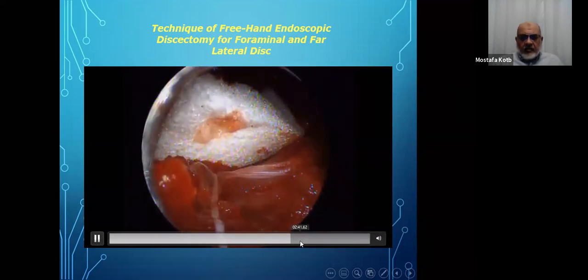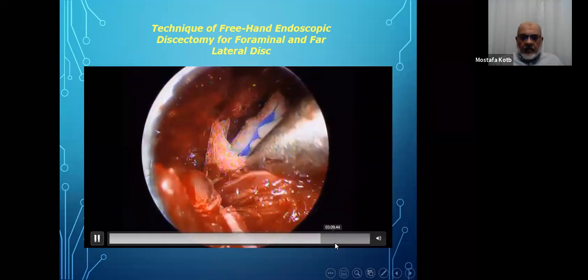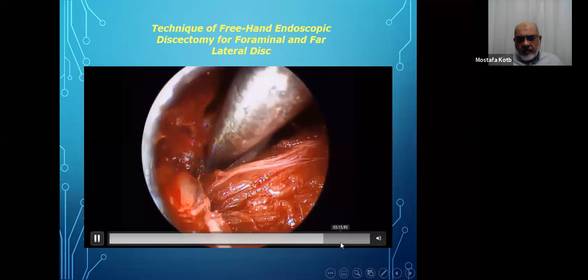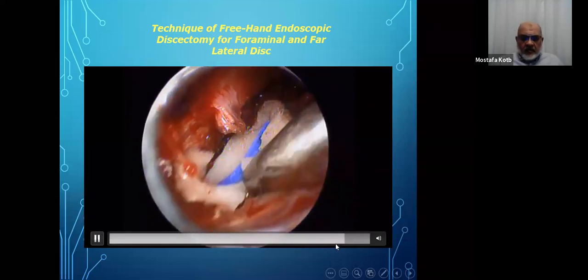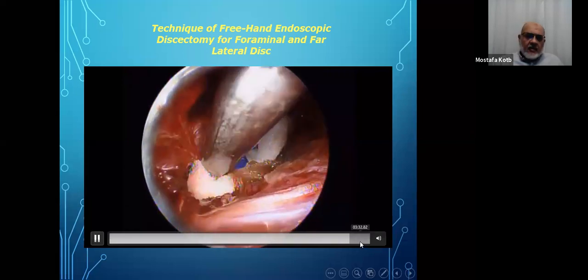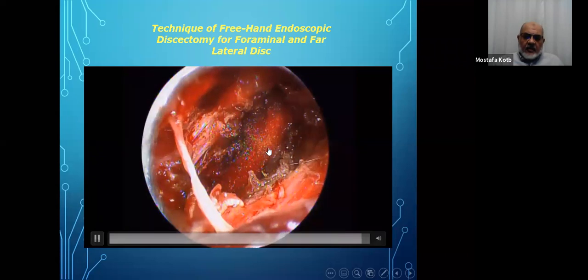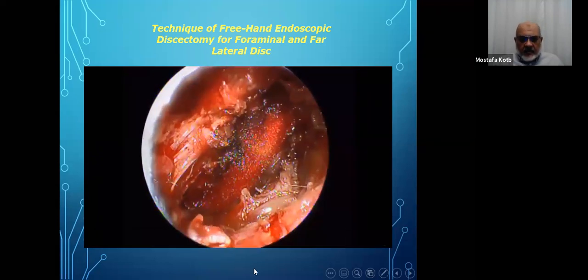Eventually you may do some hemostasis using gel foams and cottonoids, and some irrigation. And you end up with a decompressed foramen.